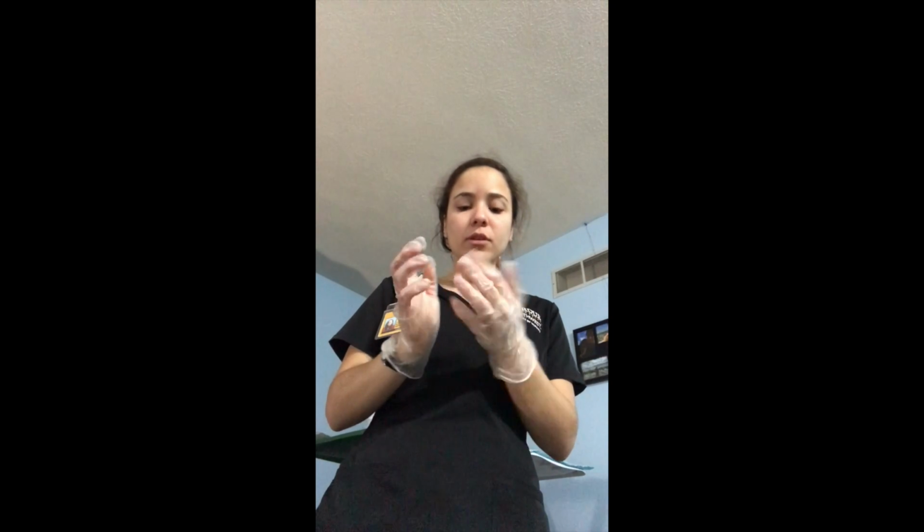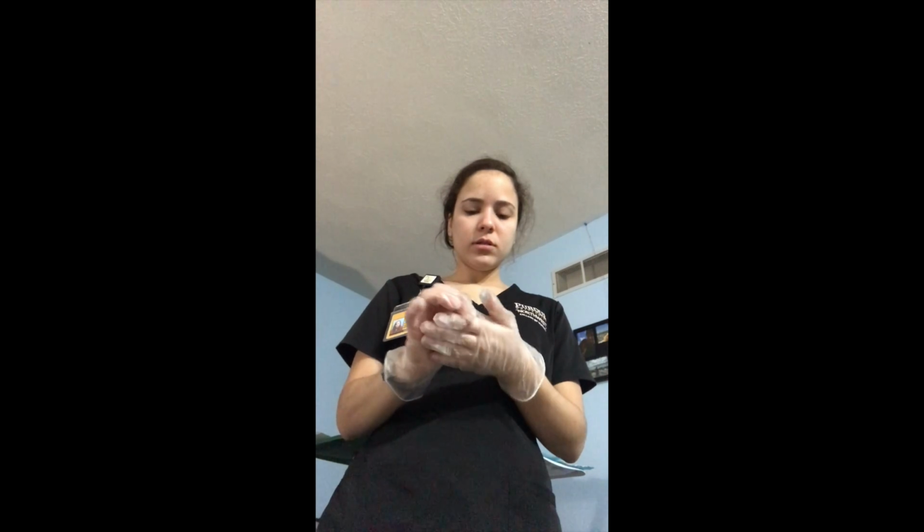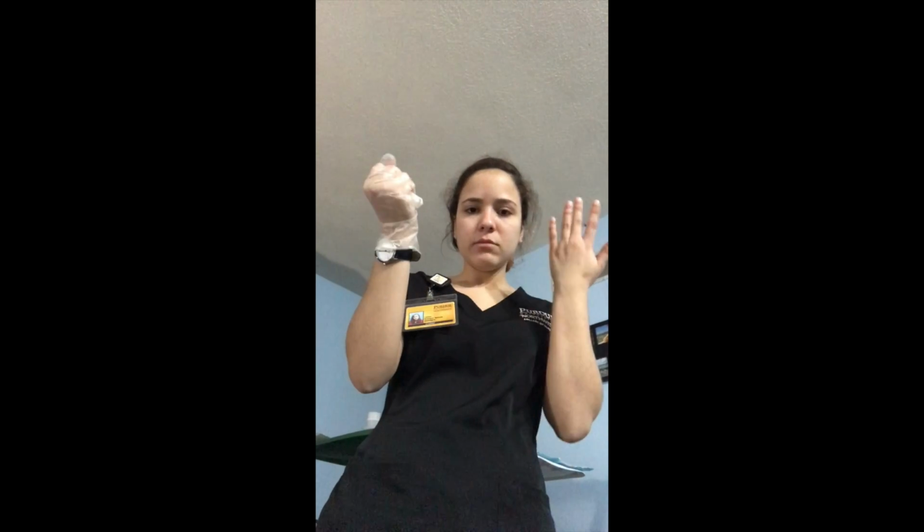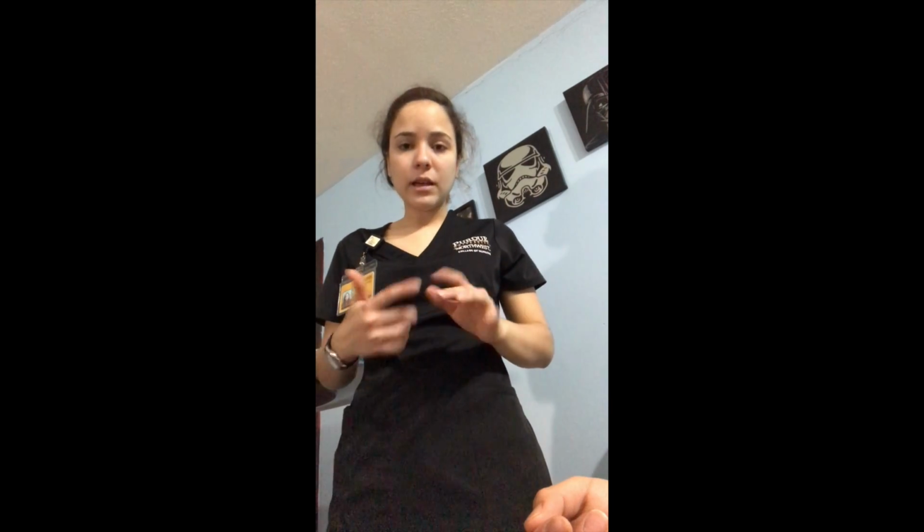After removing the dressing, we need to remove our clean gloves, which are now dirty because we touched the dressing. So we need the procedure to remove the gloves safely. I take hold of my glove and pull it off, not touching my clean hands with the outside of the gloves. I go to the inside of the glove and throw it away. When I remove my soiled gloves, I need to perform hand hygiene again before I prepare my sterile field. So now I'm going to prepare my sterile field.